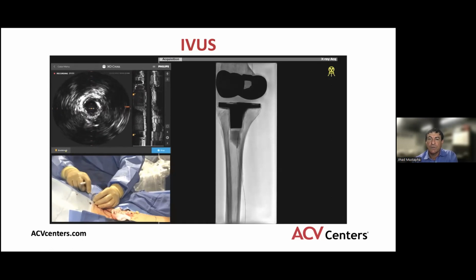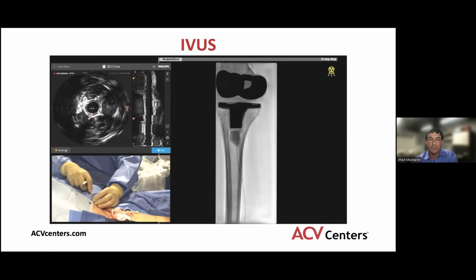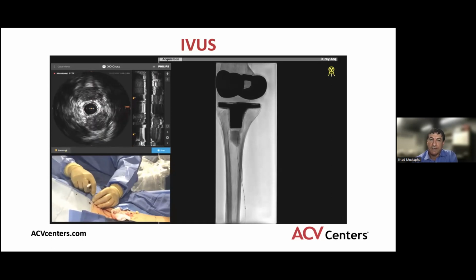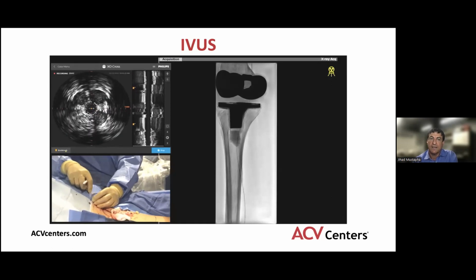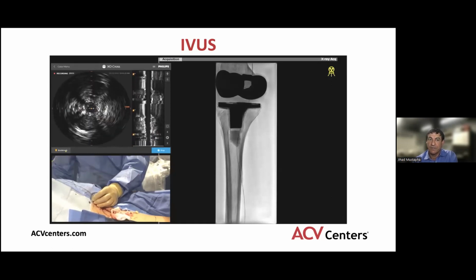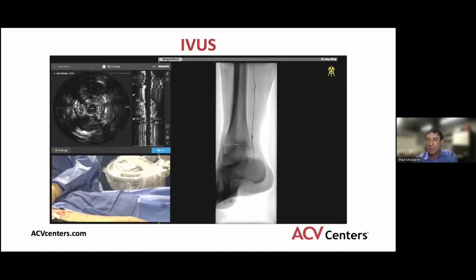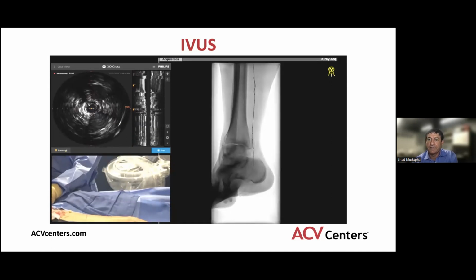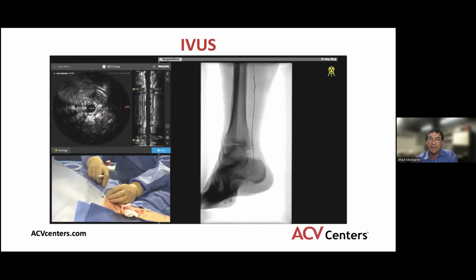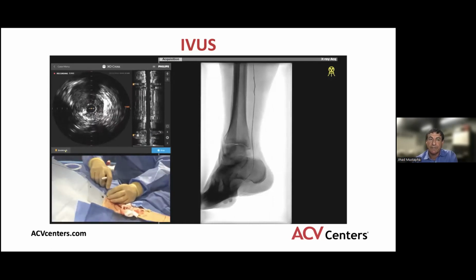And as we continue to go down toward the posterior tibial artery, notice the size of the posterior tibial artery is a reasonable size, but also notice the venous congestion, the venous size, and the multiple tibial veins around the posterior tibial artery. The IVUS was taken all the way down into the plantar artery, but notice how small the plantar artery is here. It is consistent with a low flow state, number one.